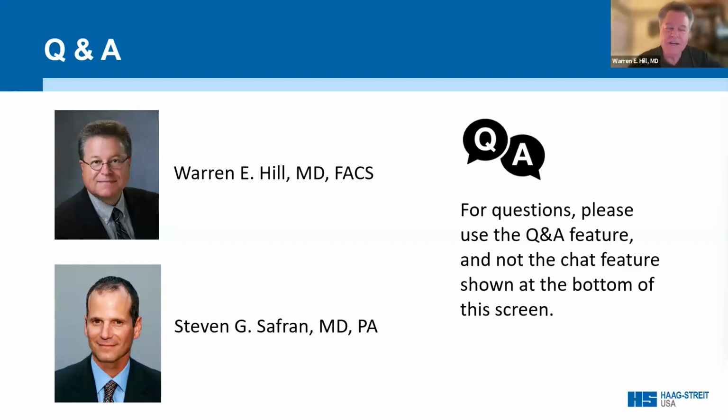Yeah, and actually the Lenstar has two algorithms. It has the Barrett algorithm, and then it also has Abulafia-Koch. And what's interesting is that these algorithms are actually one of the earliest forms of machine learning, because the algorithms contain more than just the posterior cornea. They contain a lot of other things. In artificial intelligence, it's what we call feature addition and feature extraction.